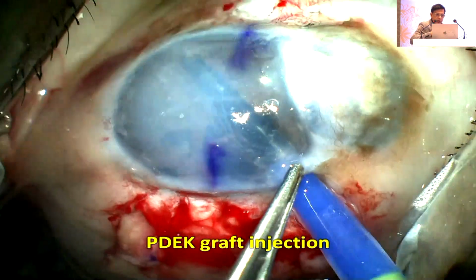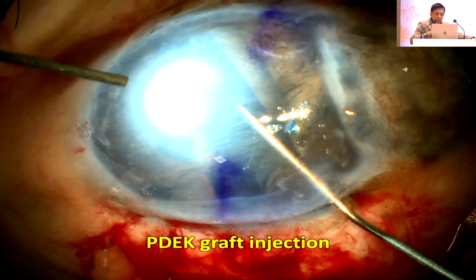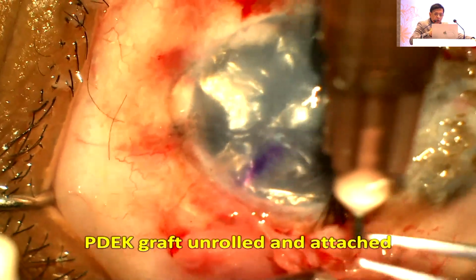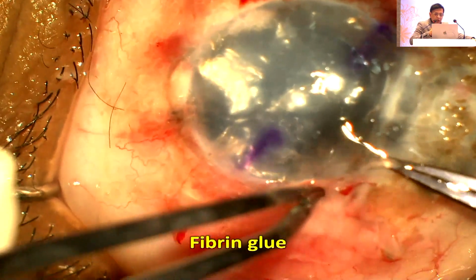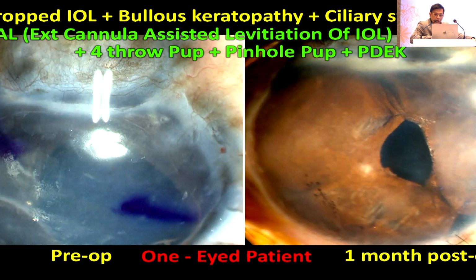So the final picture, and then we'll move to the next speaker here, is this. I'm injecting the graft. Remember once again, ladies and gentlemen, this is the only eye of this patient. It was a young patient. So after everything is done, let's see how this patient behaved at the end of the day. This is the patient post-op day 1. And you can see now 1 month post-op, ladies and gentlemen, we did dropped IOL, bullous keratopathy, ciliary staphyloma. We did the ECAL technique, did the glued IOL, did the pupilloplasty, did the pinhole pupilloplasty, and ended it with PDEK. Thank you very much.